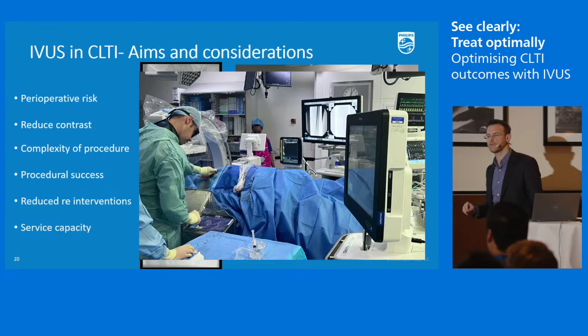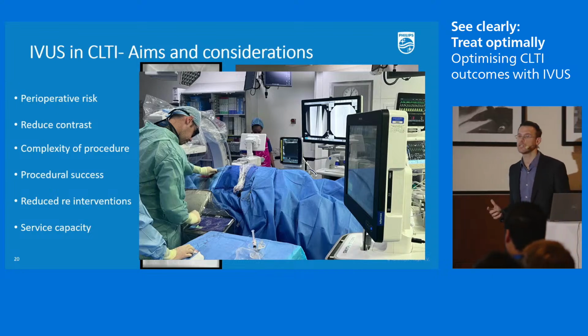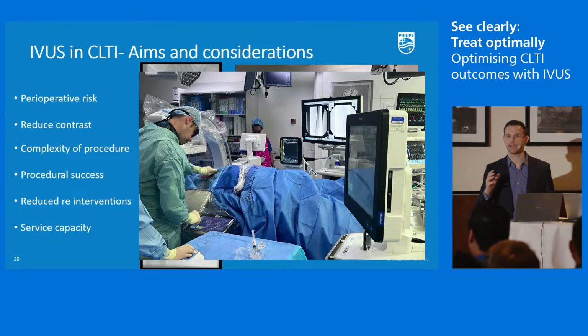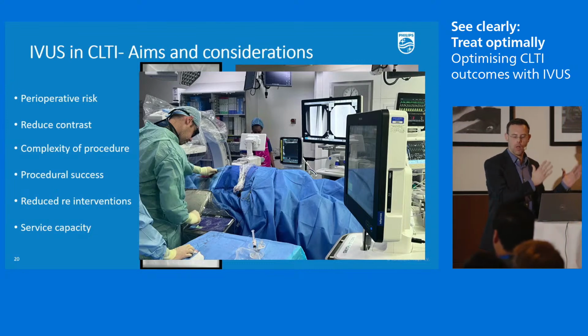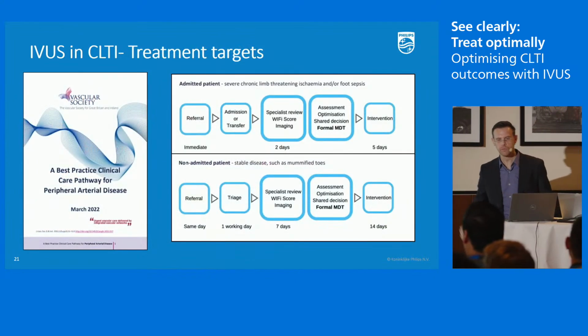One of the criticisms I've heard in the past is that it can often slow the procedure down by doing IVUS. But it has been my recent experience, now having the touchpad, that this isn't the case. It can be done as you go. And that, I think, really does start to fit into what I'm talking about here in terms of bringing in a strategy to reduce perioperative risk and improve your decision making.